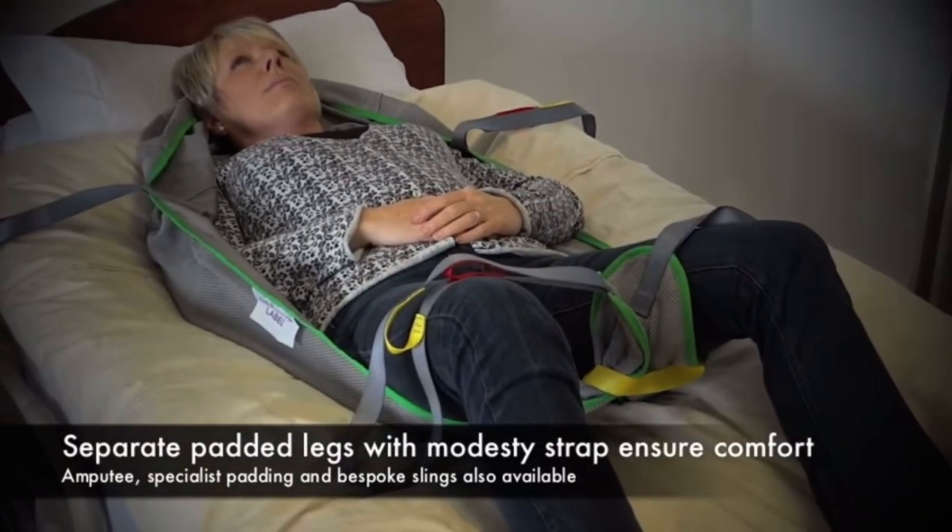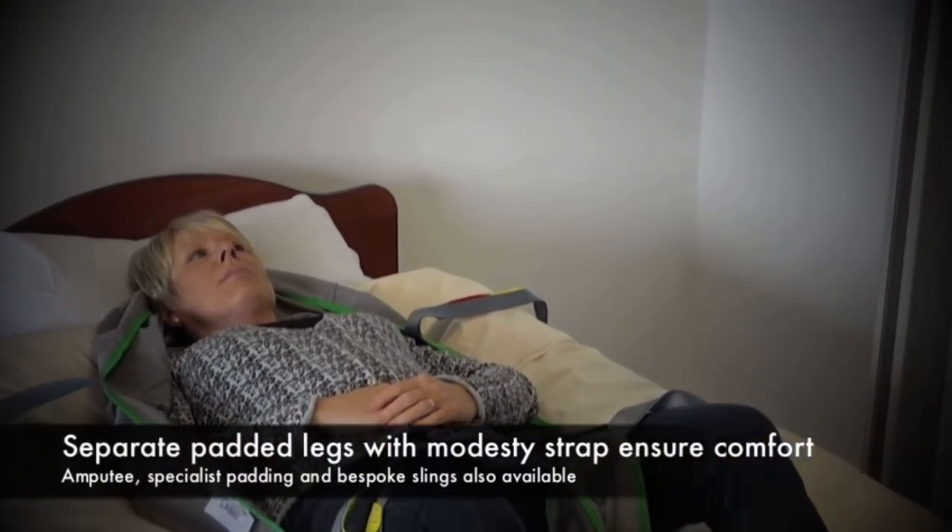This is then ready for the sling to be attached to the spreader bar, and the client can then be hoisted up.